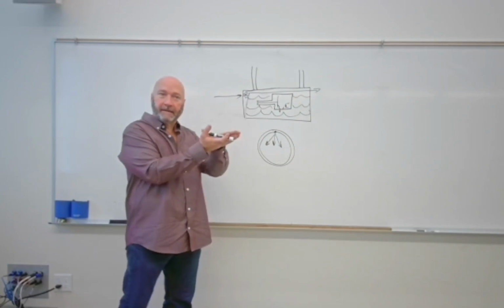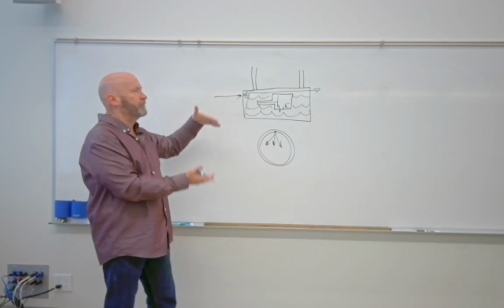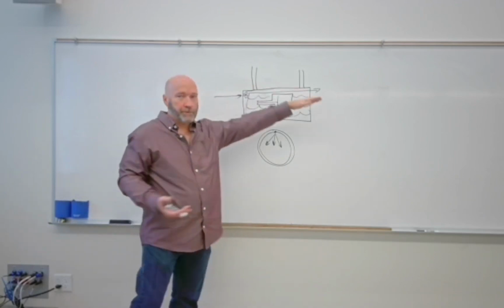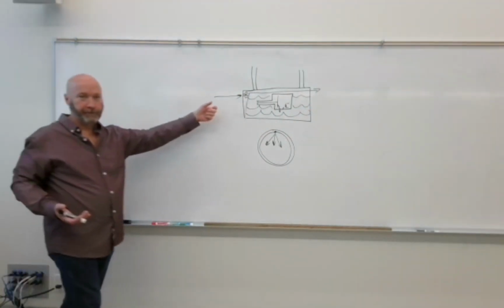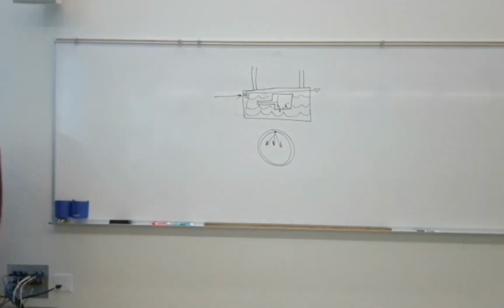But as things cool, it re-inflates, sucking cool air back into it. So then on your next exposure, it pushes it back out again. Okay. So if you see something about bellows, that's what it's referring to. It's not an active fan. It's a bellows type system that works as a fan.